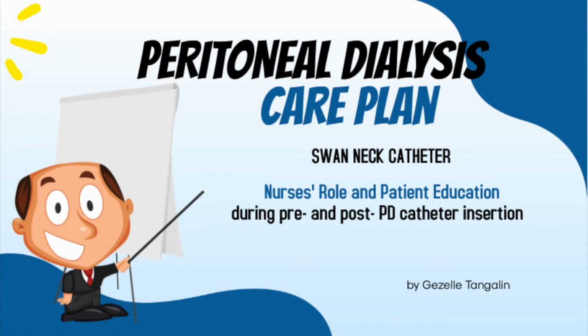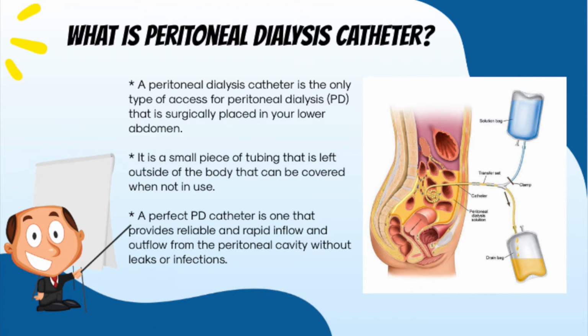Peritoneal dialysis catheter care plan. Swan Neck catheter nurses' roles and patient education during pre and post PD catheter insertion. By Gazelle Tangelin. What is a peritoneal dialysis catheter?